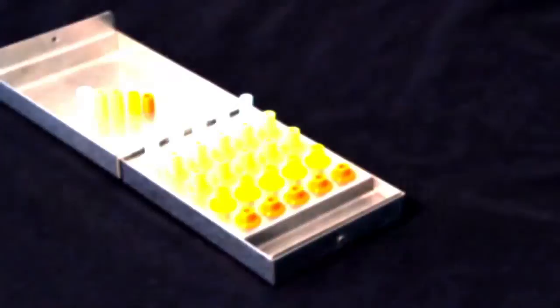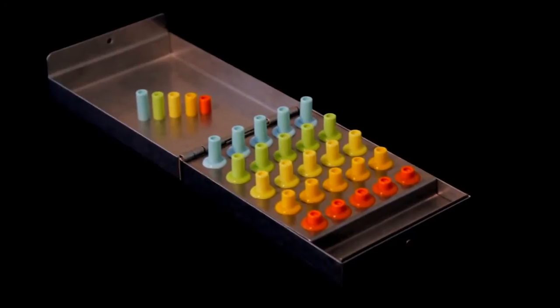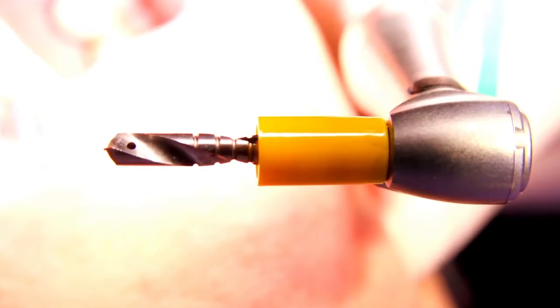Zossio Implant Drill Stops are high-density, autoclavable, polycarbonate sleeves that, when attached to surgical drills, mechanically limit continued penetration.